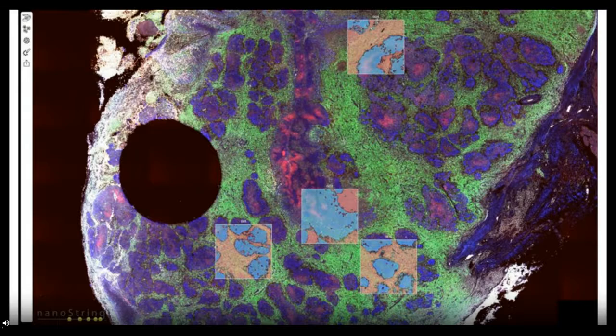Here's an example of the ROI selection process, and as you can see, each of these squares is an ROI, and you're able to cross-section those ROIs, microdissect them with the built-in image analysis tools on the platform, which allow you to segment on the fluorescent stain. So in this case, the blue marker is a pancytokeratin, which is highlighting the tumour in the sample, and we've used the onboard image analysis tools to segment each ROI into two, a tumour positive and a tumour negative ROI, and they will be irradiated and collected separately to have discrete tumour and tumour microenvironment measurements.